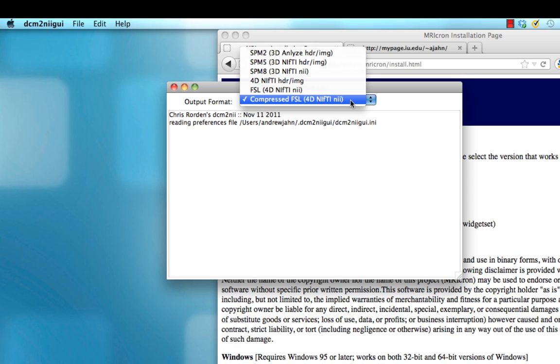This option, compressed FSL 4D NIFTI, will output NIFTI files and also compress them in order to save disk space. So let's go ahead and select that for now.